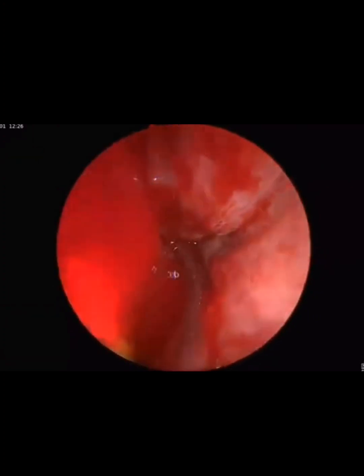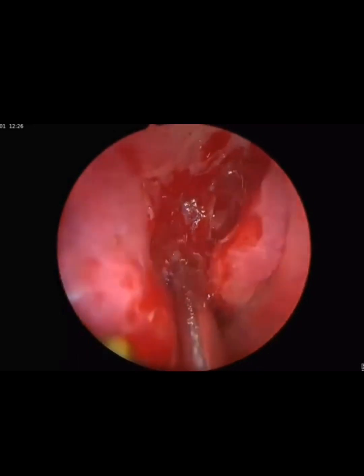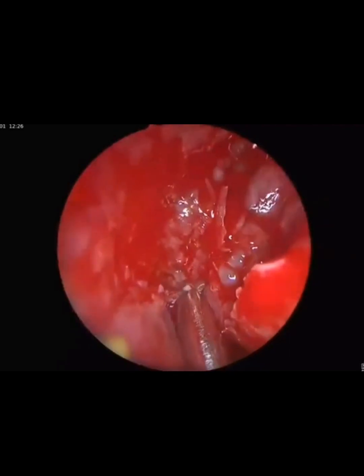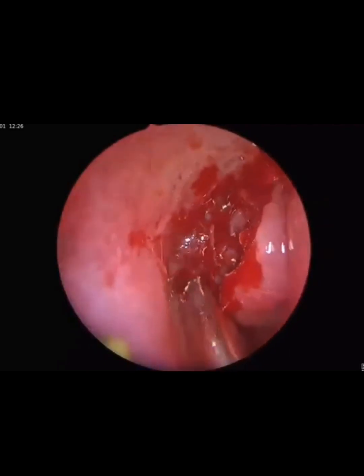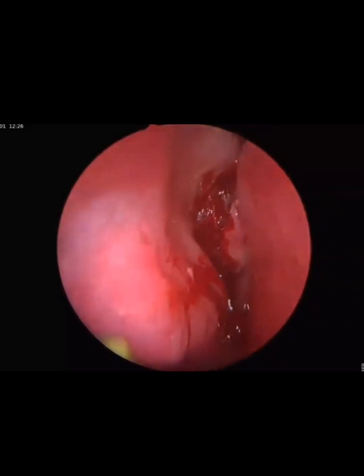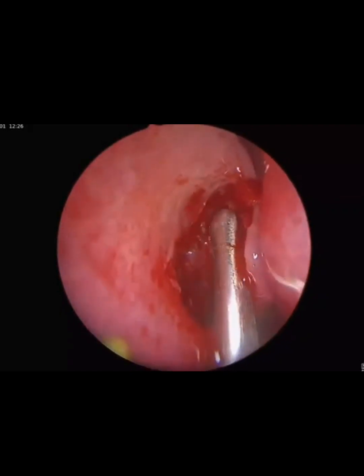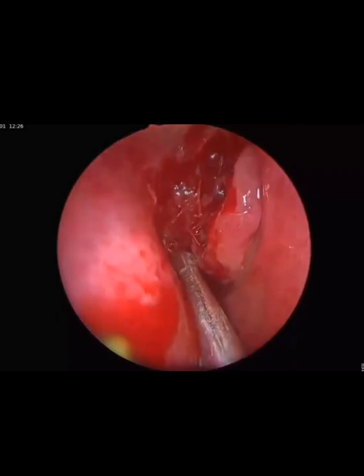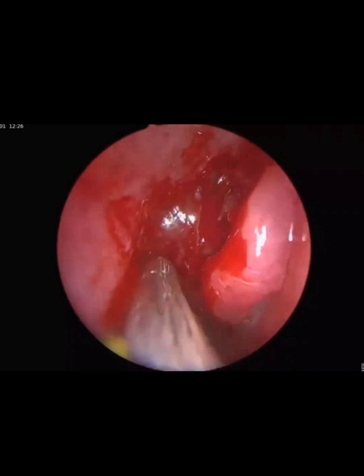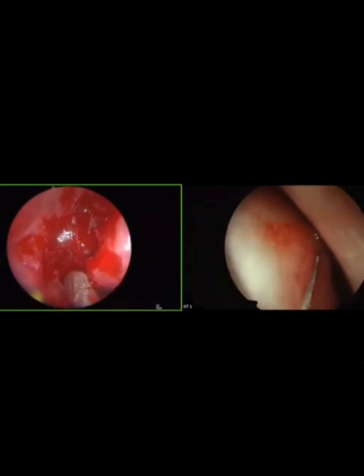Hitesh bhai. Yes, sir. Which number blade are you using? 12 or 0? Right now red 40, sir. Okay, this is red 40. Any criteria to use a particular blade in particular sinuses? Sir, for debulking, I use 0 degree. Then over the nooks and corners, like here, I use 40 degree. And after I open the maxillary sinus, I widen the sinus with 40 degree only, sir.